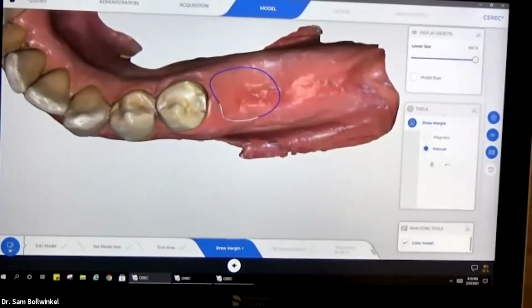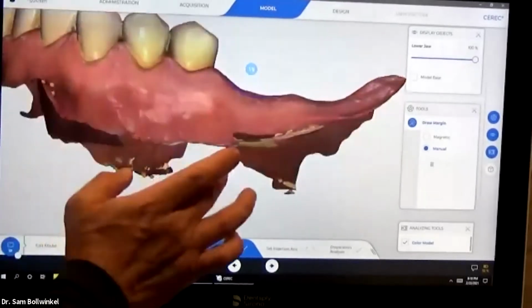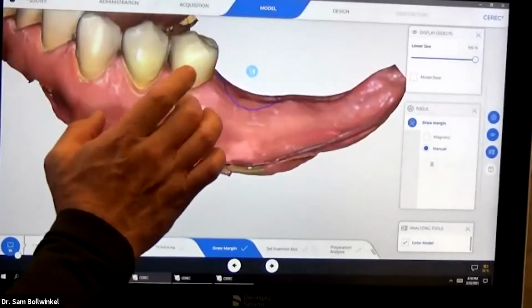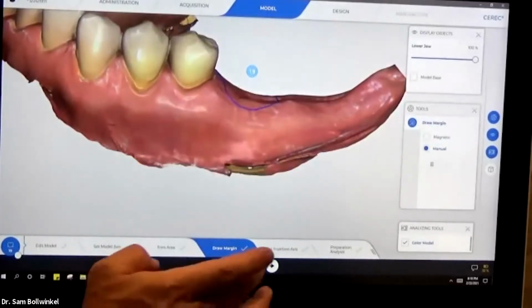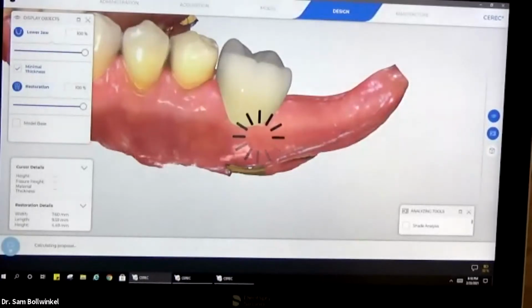And the uniqueness to that is now this really dictates on my plan how deep my implant needs to be. So knowing where my CEJ is and where my tissue needs to rest once this restoration is done is all dictated by my CEJ.